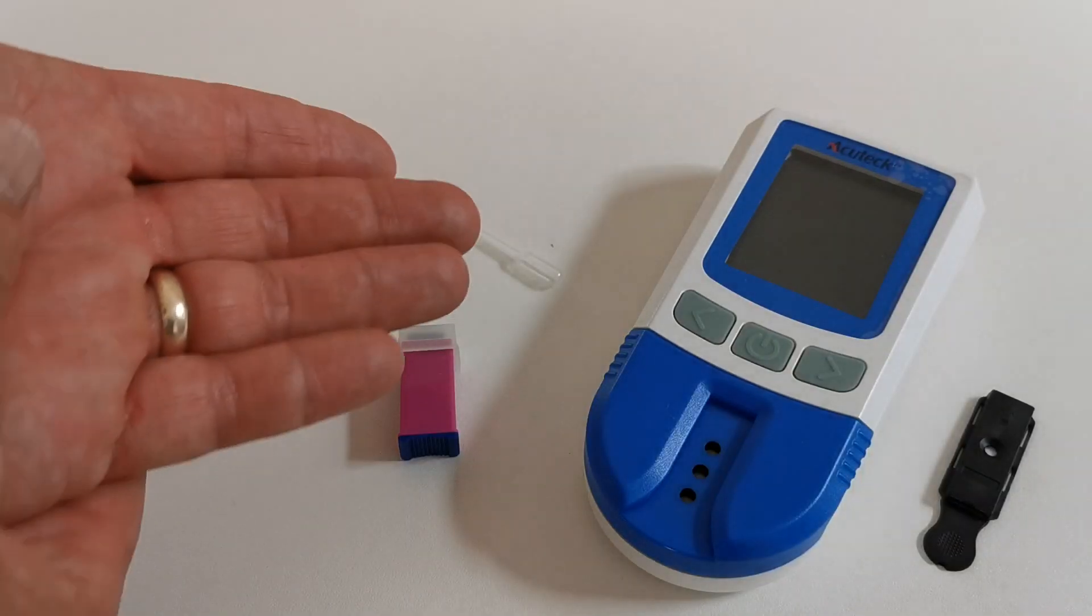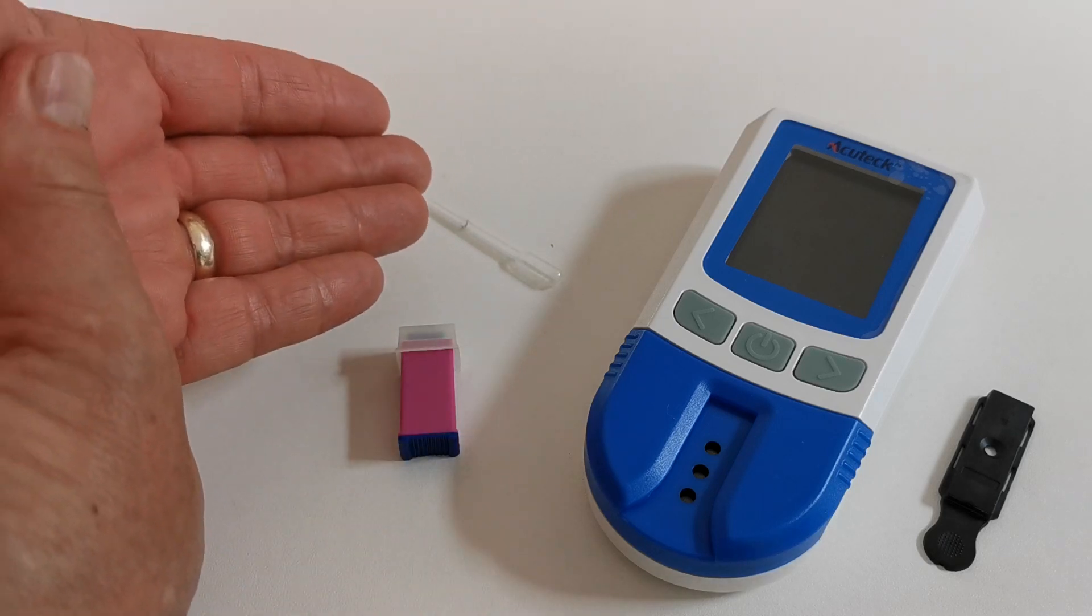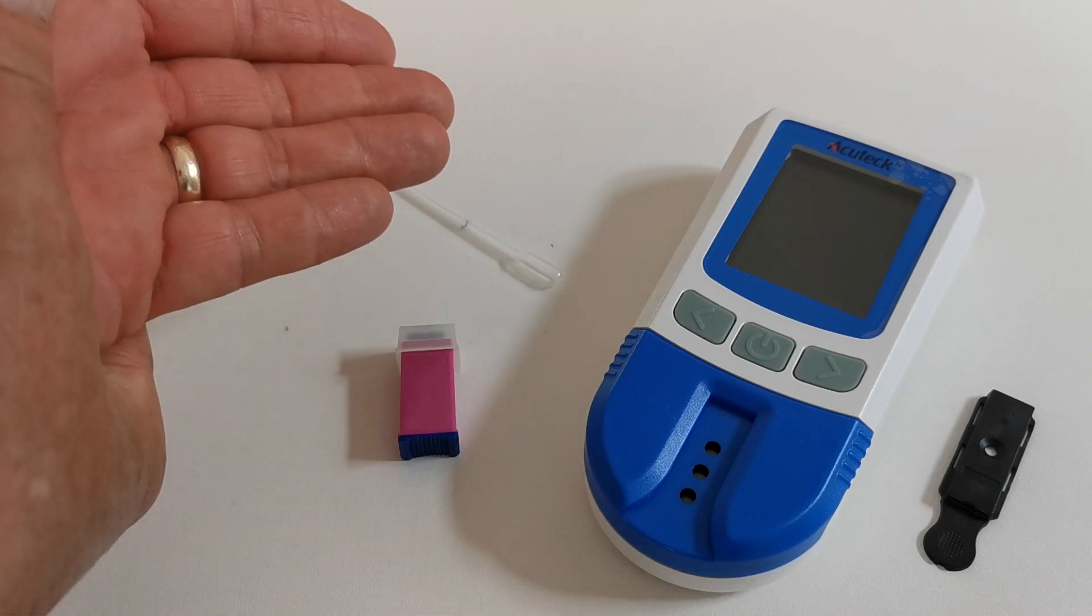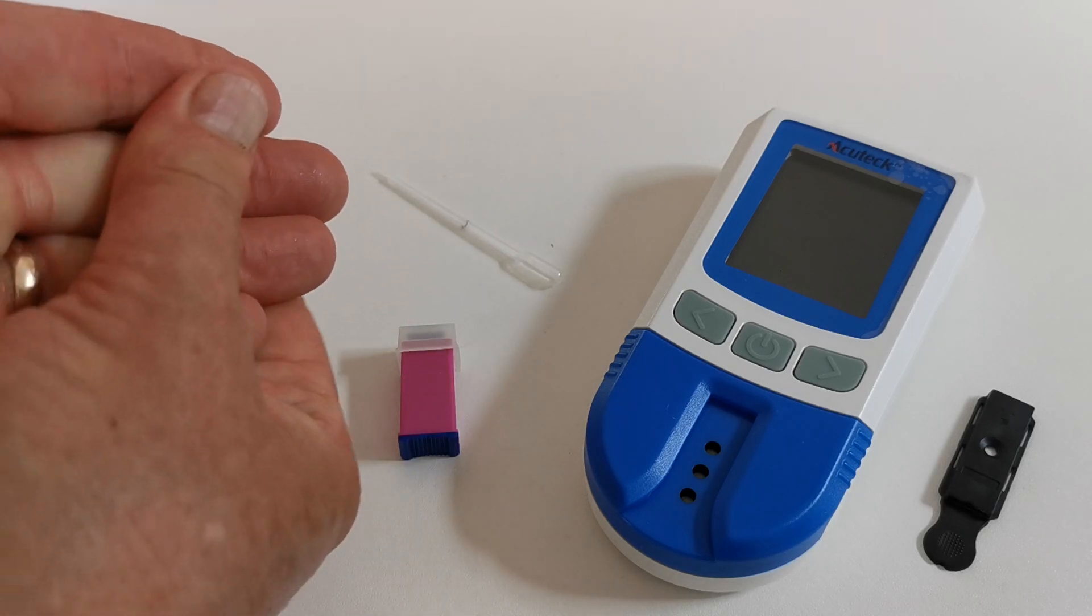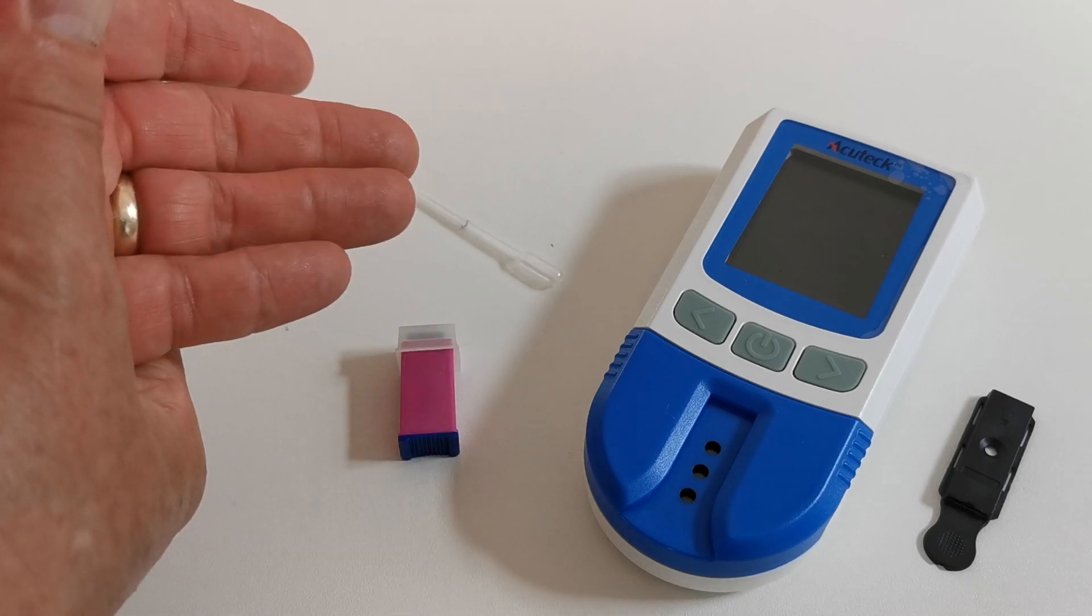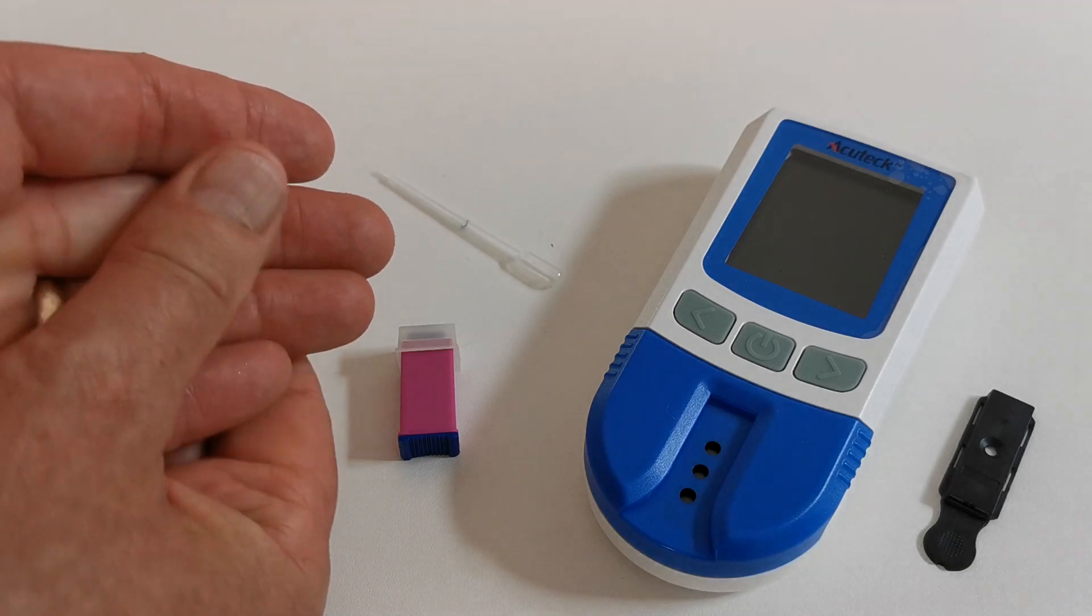Stage two is to massage the fingers in a downward motion with the palm of your hand behind the fingers. Rub your thumb down across the top of the fingers in this motion towards the fingertips. This increases the circulation and again flushes the capillaries. Do this for about five or ten times.